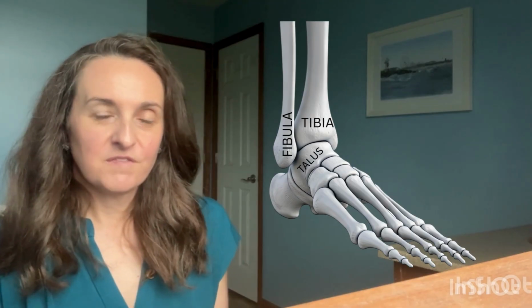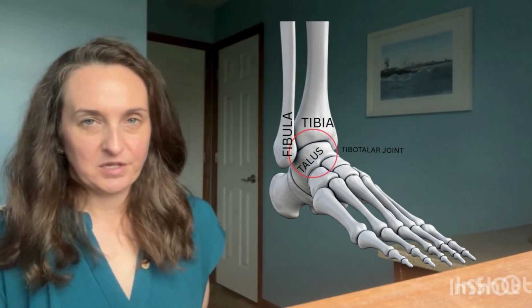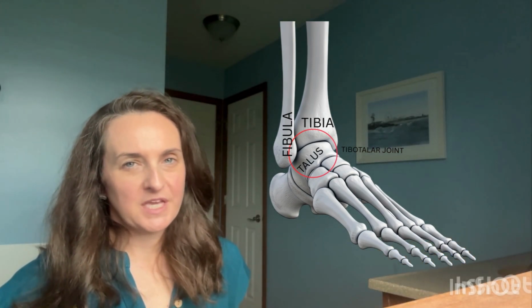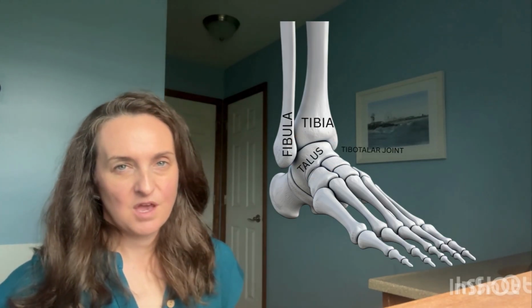The ankle joint is made up of three primary bones, the tibia, fibula, and the talus. These three bones form the tibio-talar joint, which is responsible for weight bearing and ankle stability. Because this joint space is small and complex, even slight rotation can close the joint space or hide fractures, especially around the malleoli or the talus. Proper positioning allows the bones to be clearly visualized and helps to open the tibio-talar joint space.